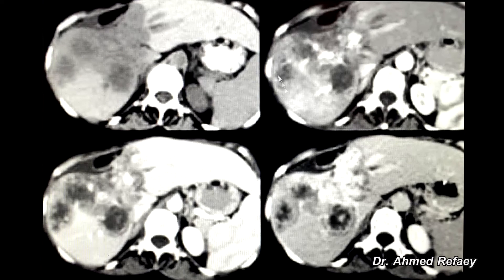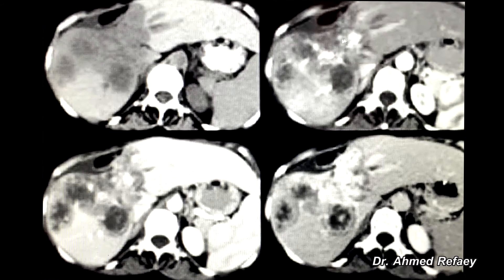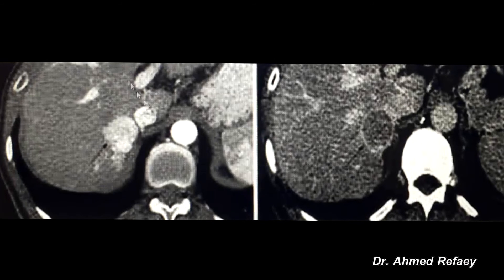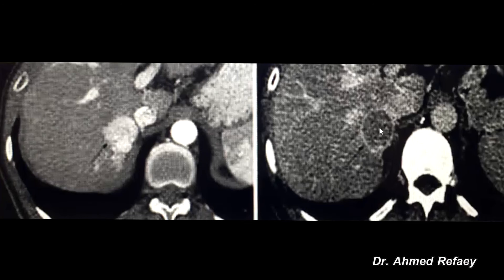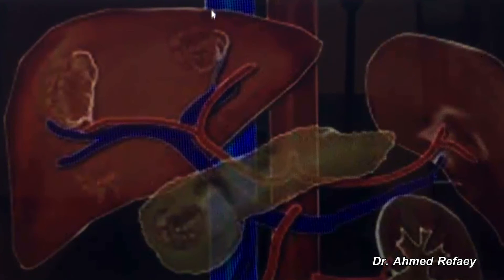This is a very good example of retention of contrast in fibrous tissue of a tumor. Selected cuts for the liver show plain study, arterial phase, porto venous phase, and delayed phase for a case of cholangiocarcinoma. Compare the mottled enhancement in the arterial phase with the enhancement of the fibrous component in the delayed phase. Another example shows a fibrous capsule of a tumor: a hypervascular lesion in the right lobe shows complete washout in the delayed phase denoting malignant behavior, with marked enhancement of its fibrous capsule.